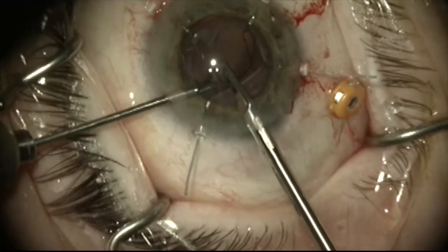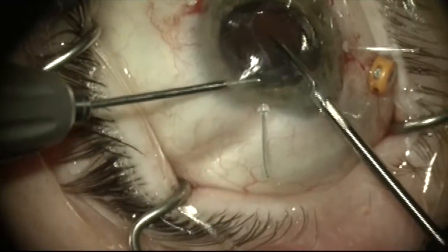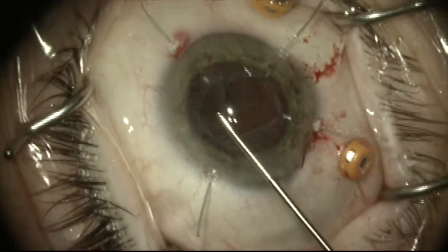Once the optic is freed up, it is cut most of the way through so I can manipulate it out through a relatively small incision in the clear cornea.